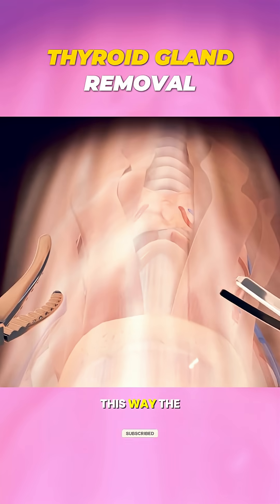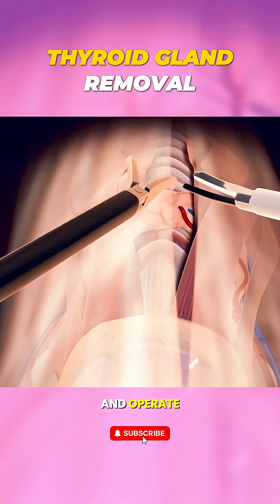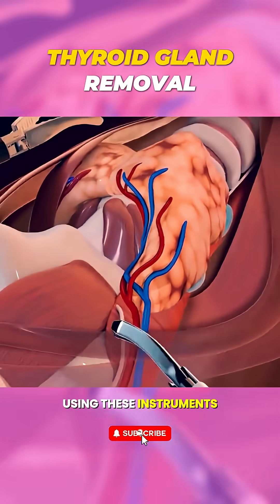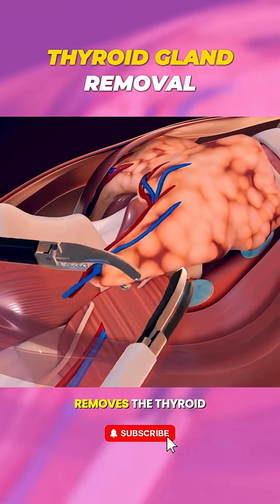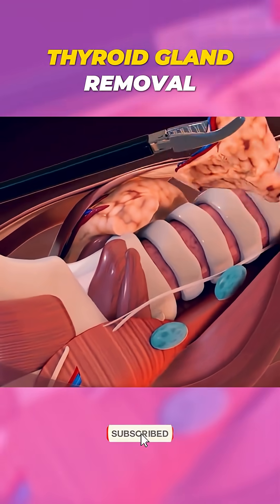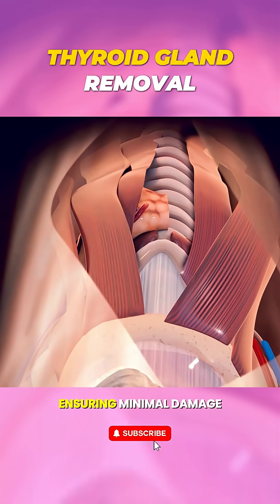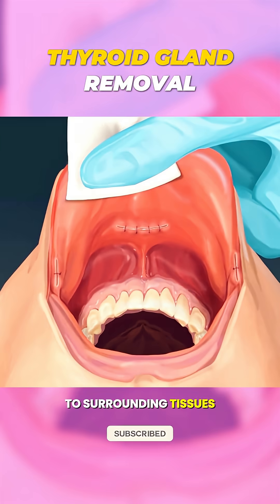This way, the surgeon can see and operate without leaving a visible scar on your neck. Using these instruments, the surgeon carefully removes the thyroid gland. The whole process is precise and controlled, ensuring minimal damage to surrounding tissues.